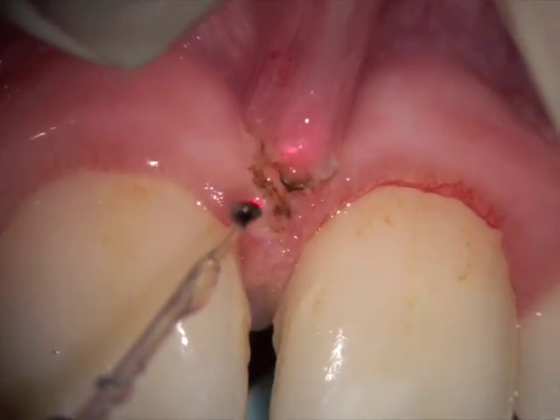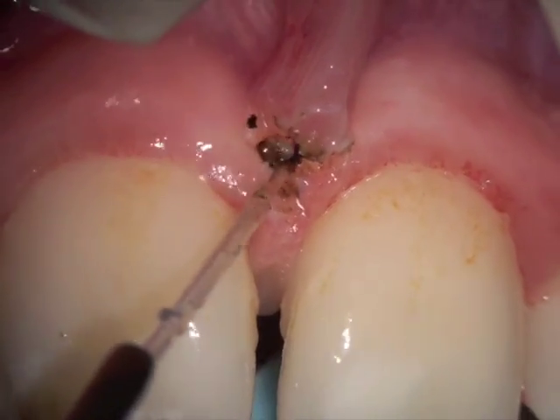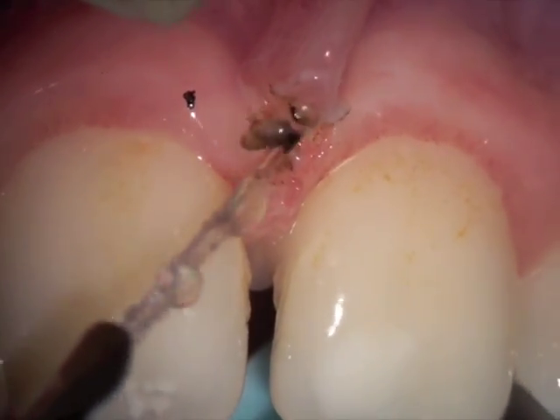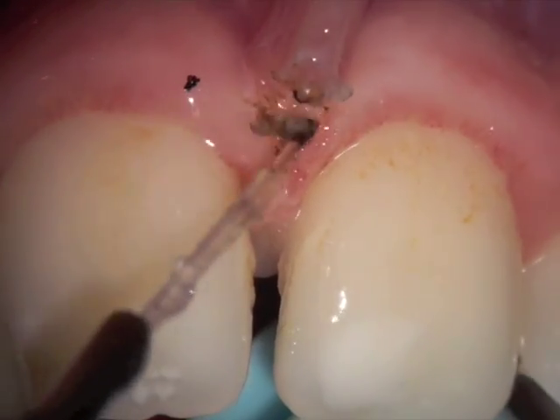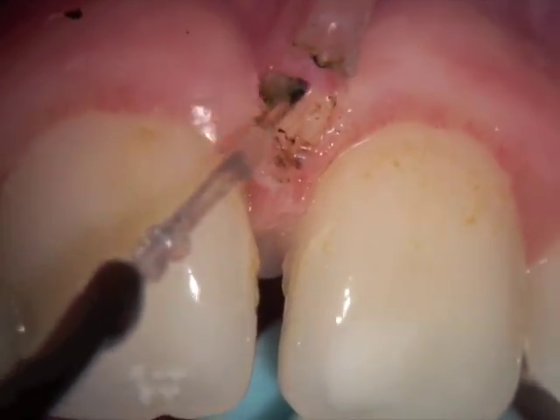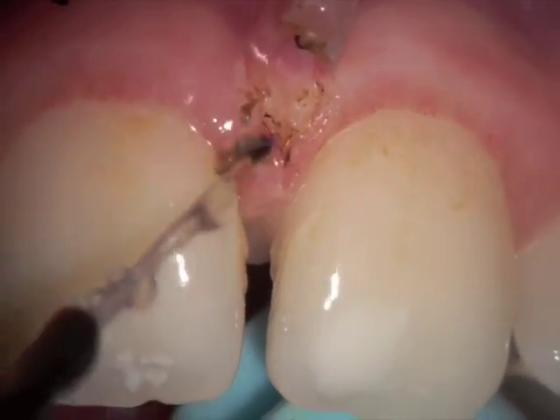We increase the power settings to five watts continuous wave with a fine stream of water. This is a high-fluency technique, which is a little bit more advanced. As we're pulling with tension on our left hand, you can see the right-hand initiated tip is beginning to create a cut.